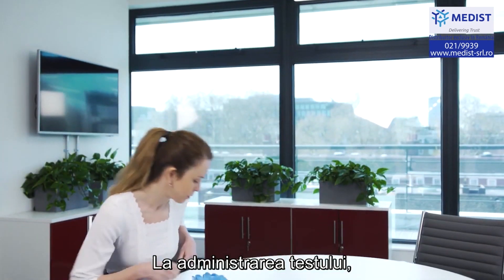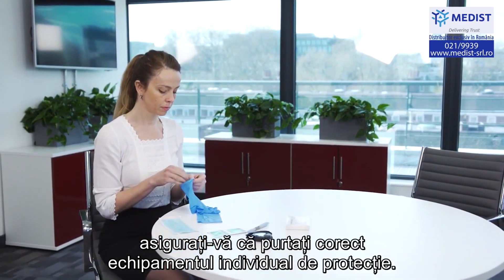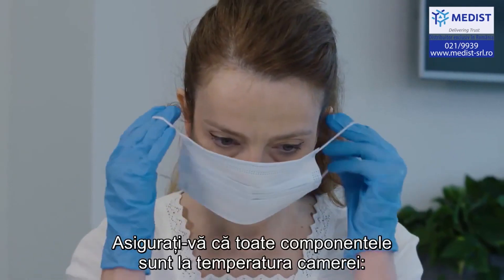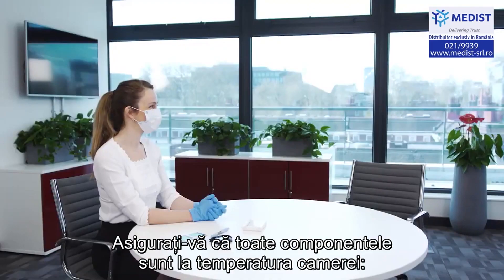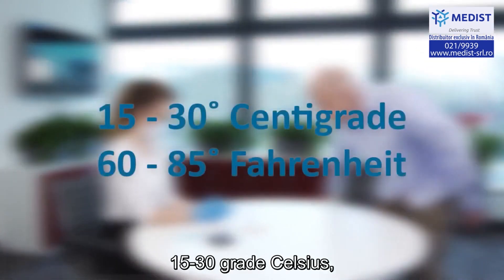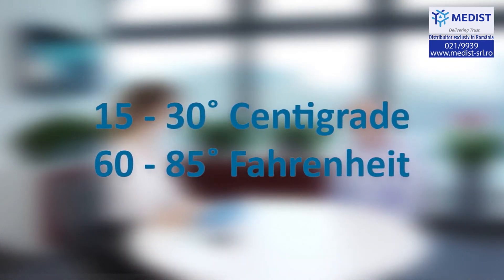When administering the test, please ensure that you are wearing the correct personal protective equipment. Ensure that all test components are at room temperature: 15 to 30 degrees centigrade, 60 to 85 degrees Fahrenheit.